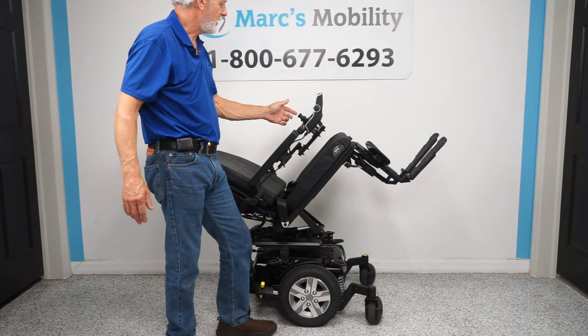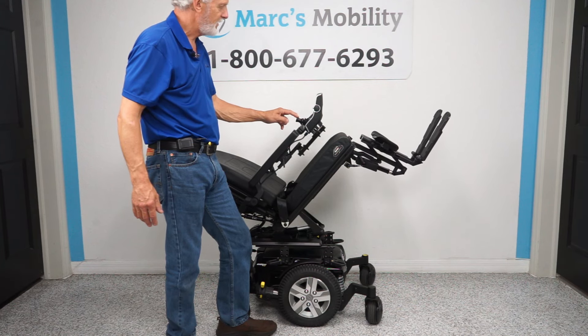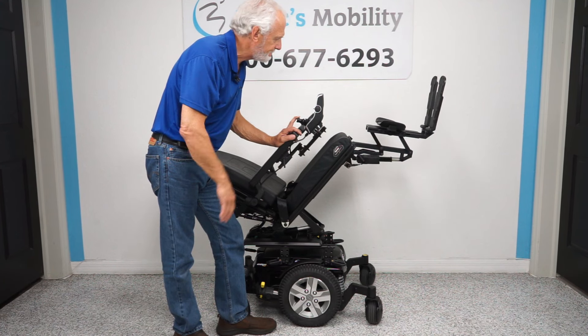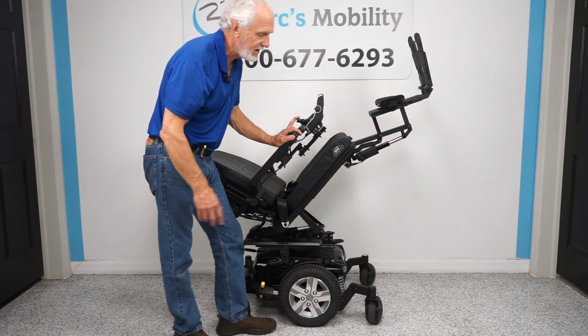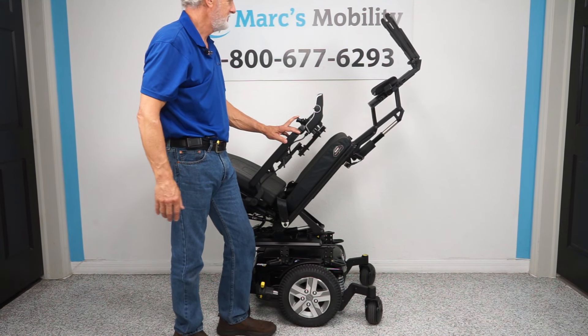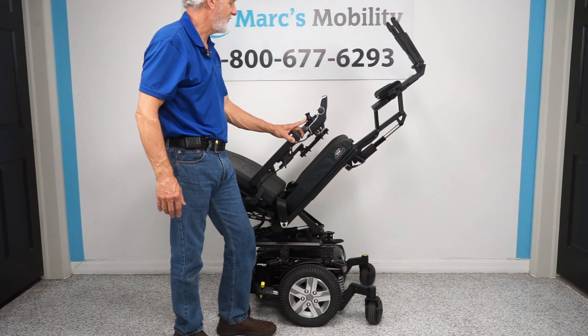Next, I'm changing the color to yellow on the feet, and now you've got your feet function. Look at how high you can get your feet on this chair — you'll practically be on the ceiling. That's a little extreme, but you'll have great circulation. You don't have to go that high, so I'll bring it back down halfway.